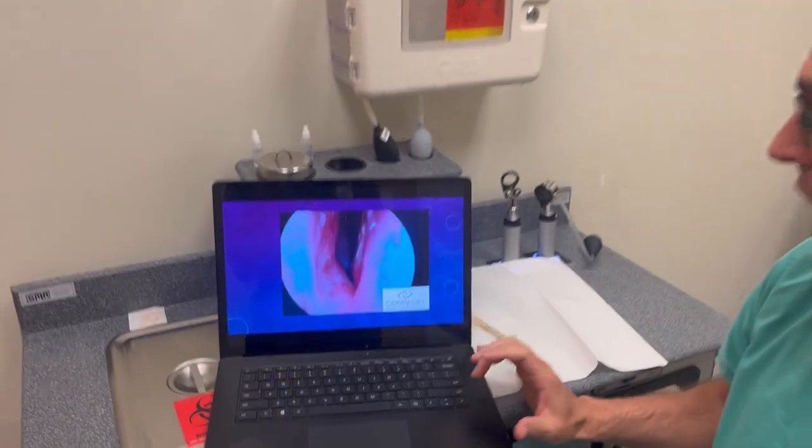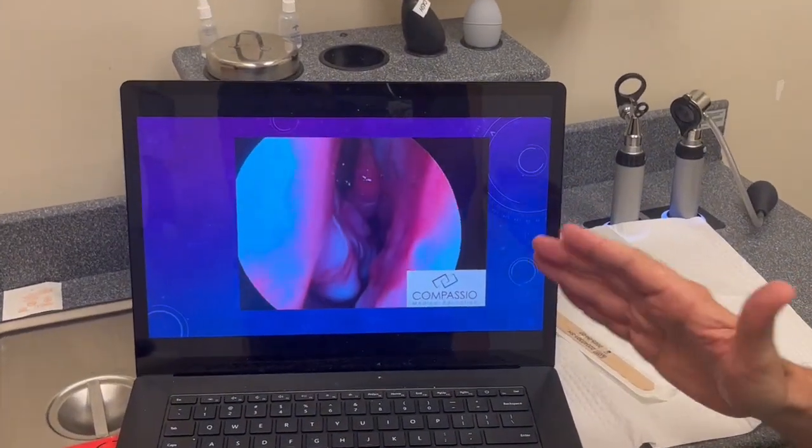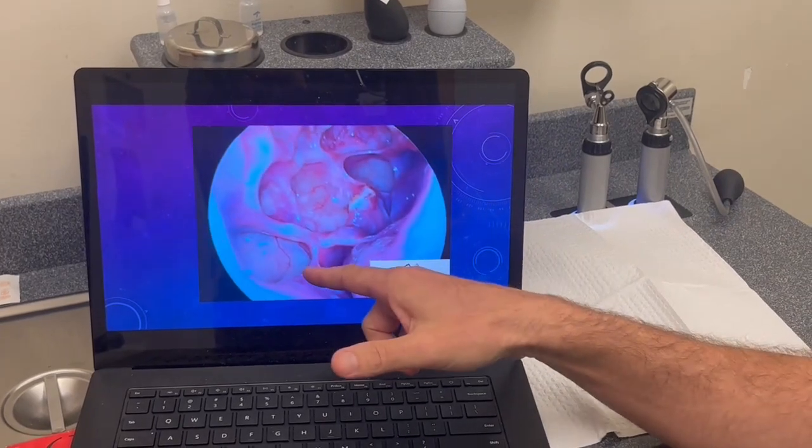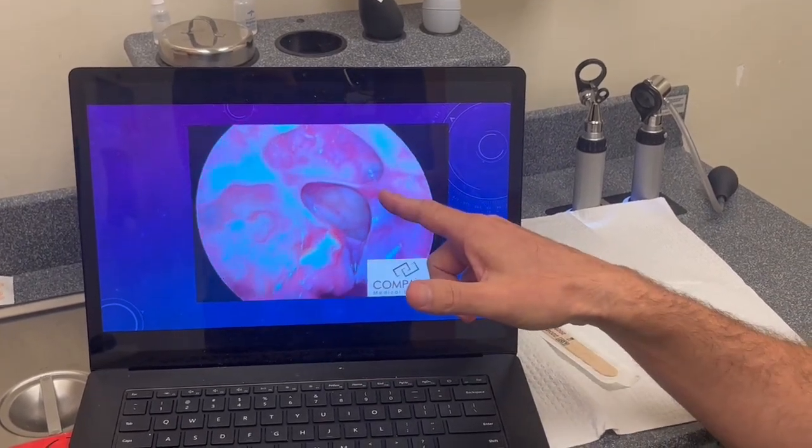So let's look at a patient of mine who had sinus surgery. This is the right nasal cavity, inferior turbinate, middle turbinate, maxillary sinus right here, sphenoid sinus right here.